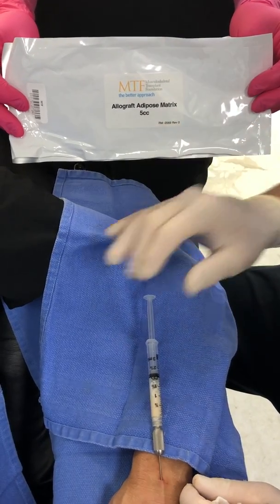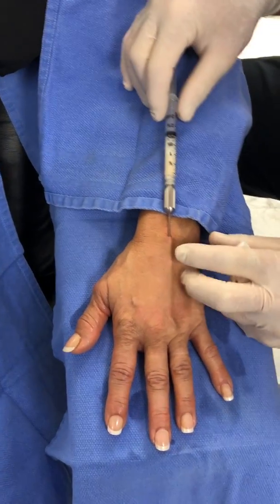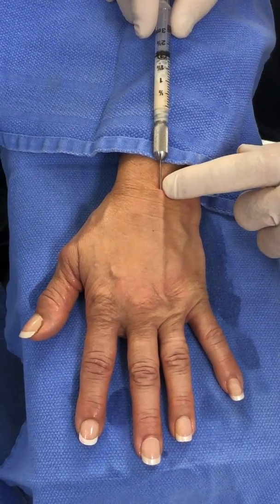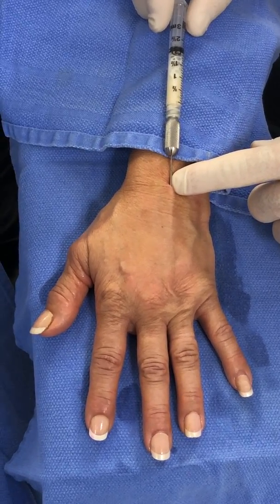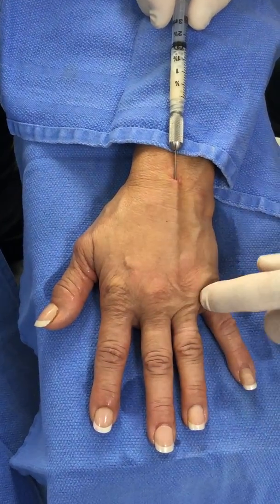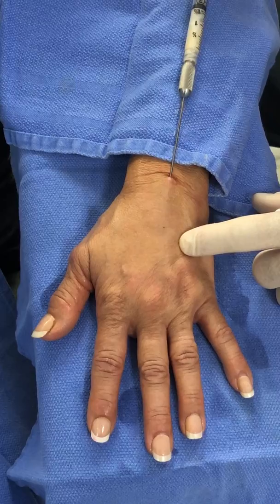We're continuing our injection of allograft adipose matrix, doing 5 cc's per hand and doing the area now between the tendons. At first I did the knuckle pads. I pre-injected with a Marcaine xylocaine mixture with epinephrine — about a cc and about 0.3 cc's over each knuckle pad — to rejuvenate them, and then we're injecting in retrograde fashion between the tendons.